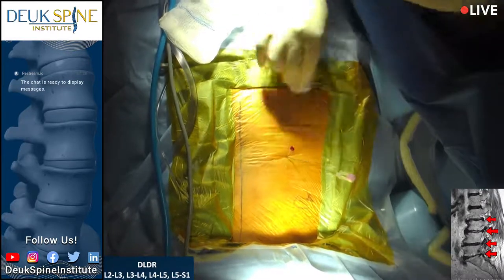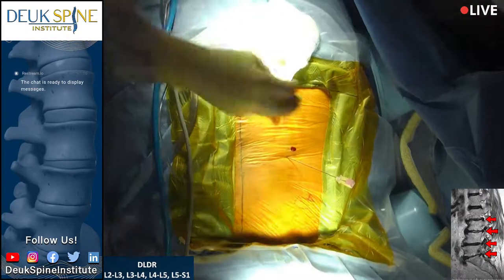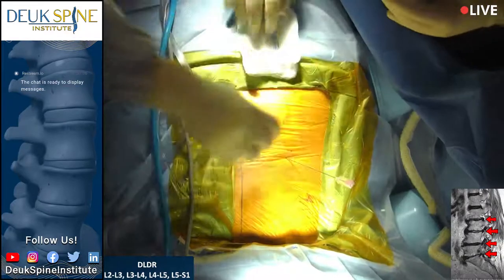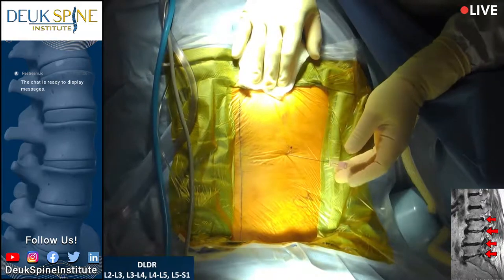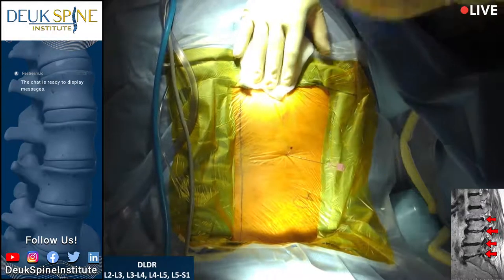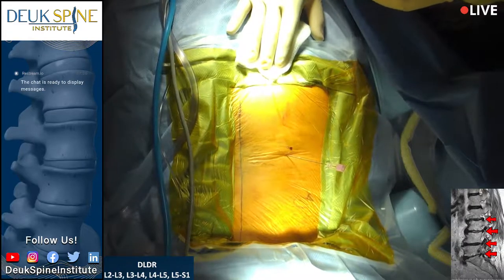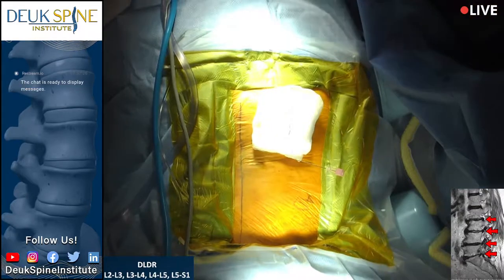What's wrong? Why can't he get comfortable? So sedate him. Just give him a little bit, enough to make him not really care about being claustrophobic. Give him some of that, what is it you give him? The dissociative anesthetic, ketamine. I need him to be able to respond. And I'm going to be there soon.